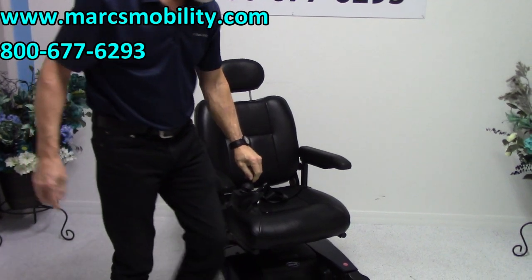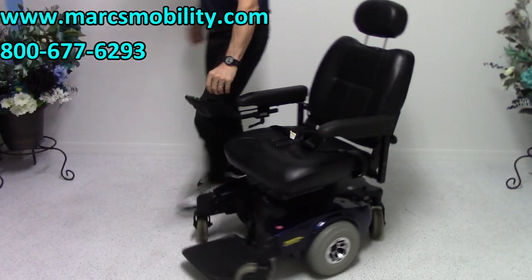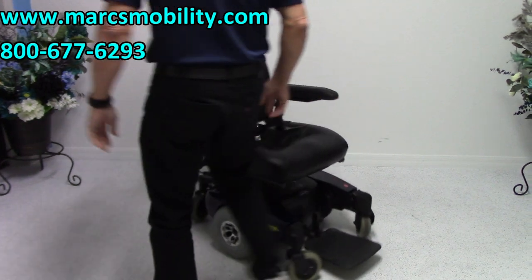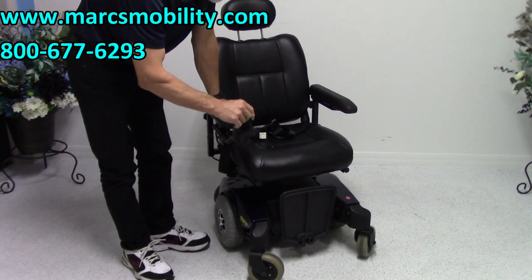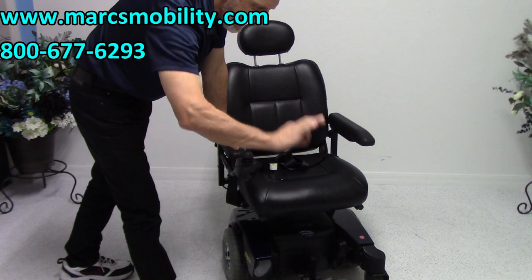This chair will turn on its own length all day long. So if you need a power chair that has a real short turning radius, it'll turn on its own length all the time. The foot plate does flip up, so you have nothing in the way when you get out. This foot plate can also be adjusted up and out a little bit.